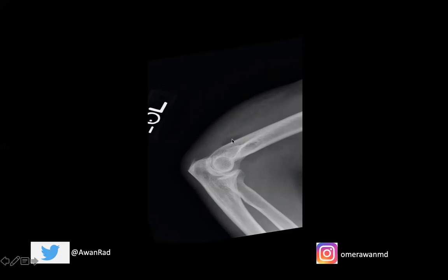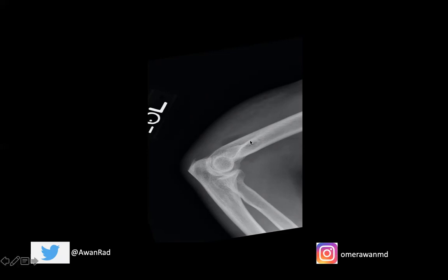We should never see a posterior fat pad. So if we see a posterior fat pad on a properly performed lateral elbow X-ray, that indicates the presence of a joint effusion. You can normally see an anterior fat pad, but it shouldn't be this large and certainly shouldn't be displaced anteriorly. When it is enlarged and displaced anteriorly, that indicates a joint effusion.